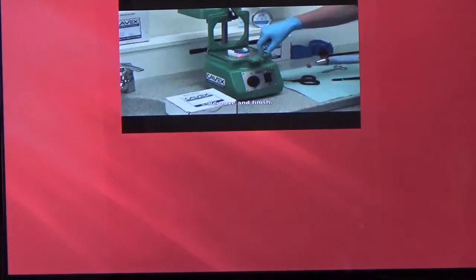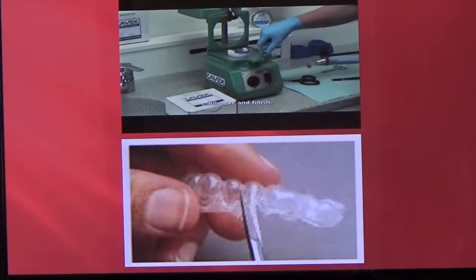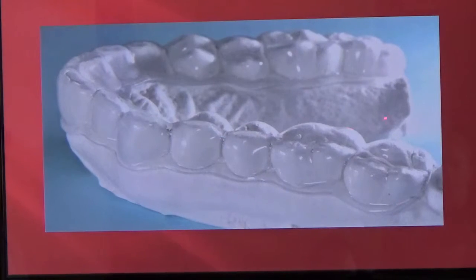There's a machine. You put your model there. You put your plastic, and once you get it, you trim it. Be careful with your scissors. Don't cut your fingers. And this is kind of what you want, as close to the gum line as possible. Okay, and there's different ways. I cut it right to the gum line. Dr. Cervantes cuts it a little bit different. Again, main thing is you don't want too much out here so the material won't go onto the gums and bleach the gums.